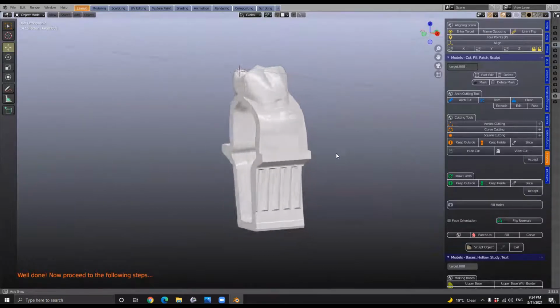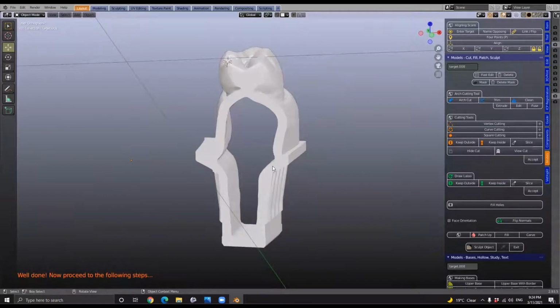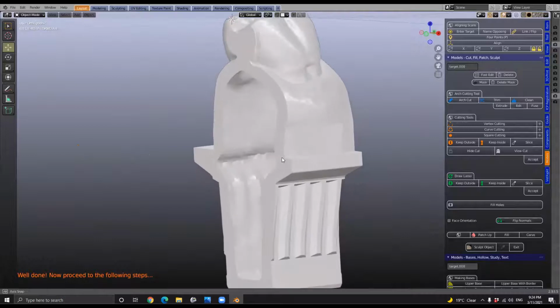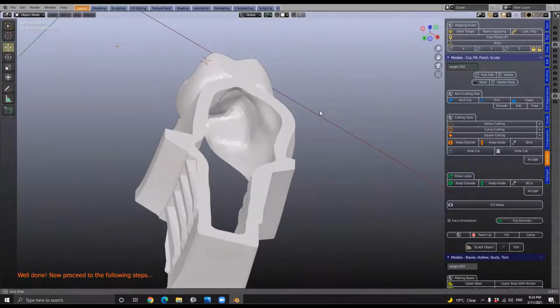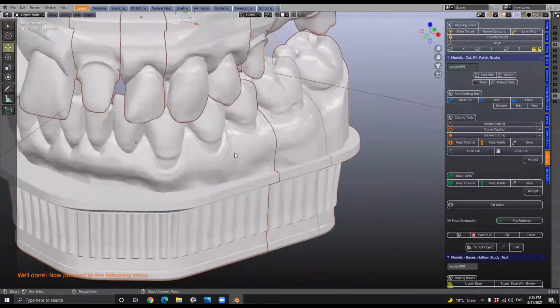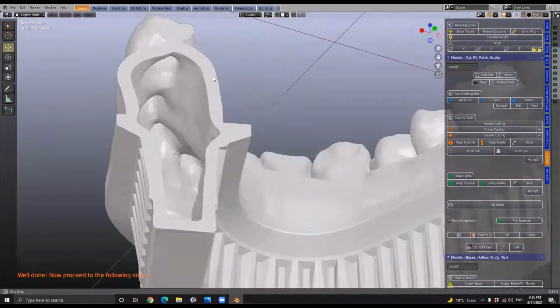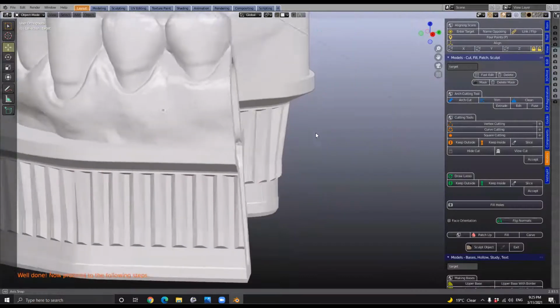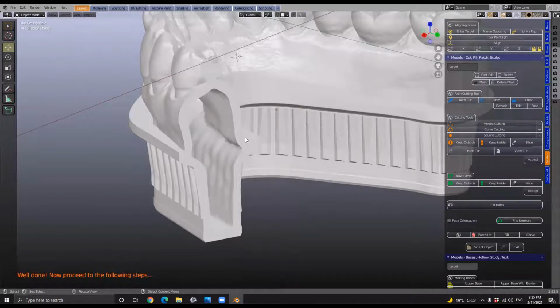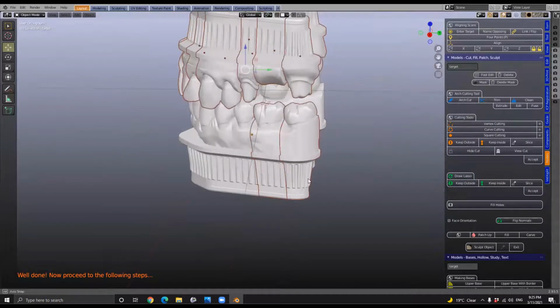I love it. Wolfgang, you've tested this, have you? Does it give a bit of flexibility on the sides? It does. But when I print it like this, I have to put boiling water on the aluminium plate so that it expands, and then I can get the dies off without busting them off, because the solid structure is more resilient to removing from the build plate. So you've got to be more careful and mindful of that. Good point. And you wouldn't be saving that much resin anyway, would you? Sometimes we really need solid dies to work on. Yeah, I suppose it depends. Each to their own.